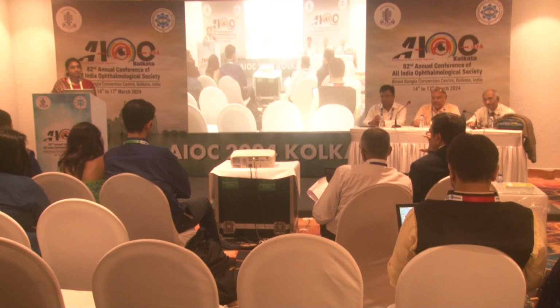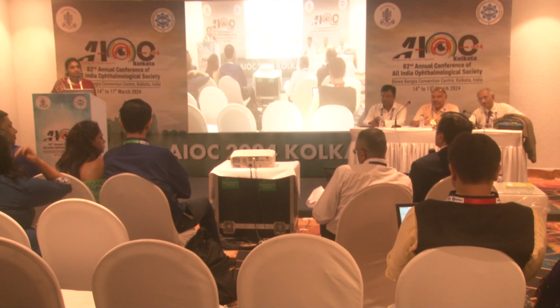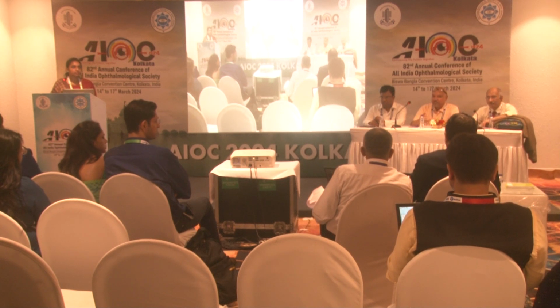Second, in your experience, when does the dye first appear after taking it orally? And sir, how much time? So within like 5 minutes, we're able to see the dye. Yes, sir. 5 minutes is given as the classical.